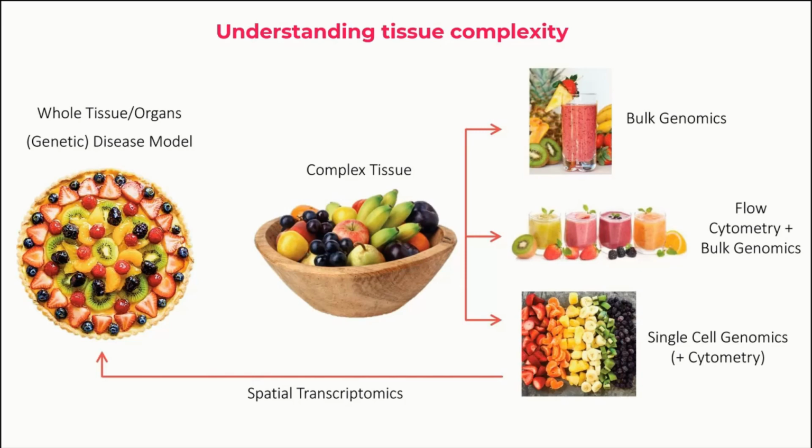And that becomes really powerful in trying to understand how the organ is adapting to these tumors that are growing in them. How are the immune cells infiltrating the tumor? Are they on the periphery? Are they in fact infiltrating? And it's not just composition, but it's location, and getting all that tissue contexture is really important. And so this is what the revolution's been over the last couple of years.